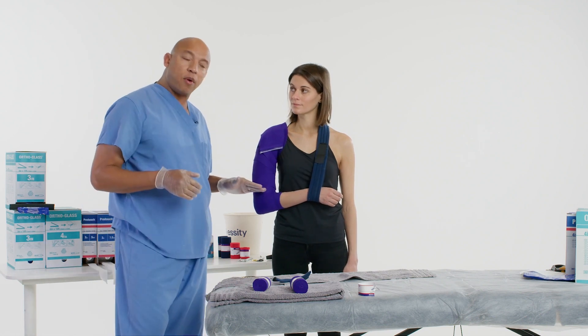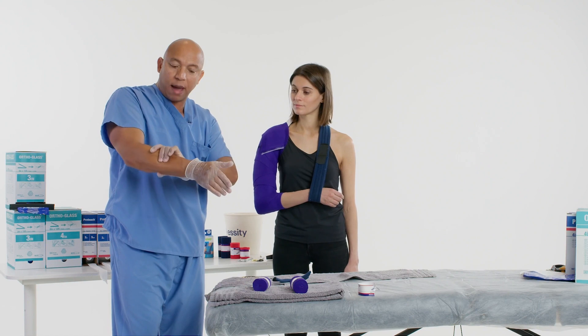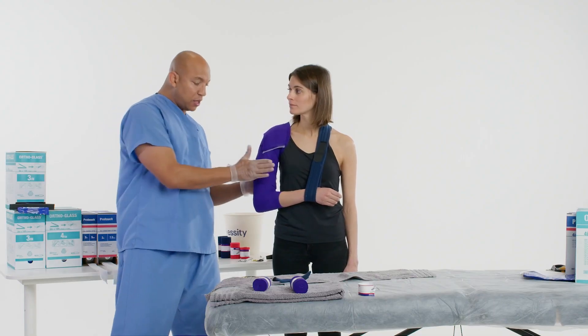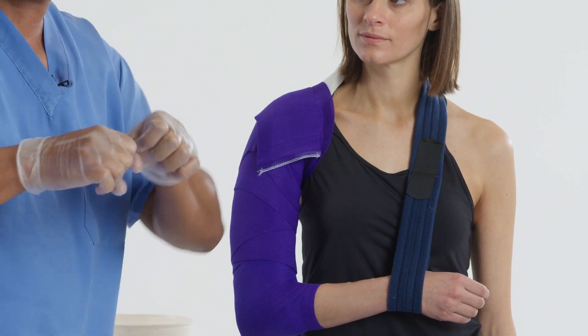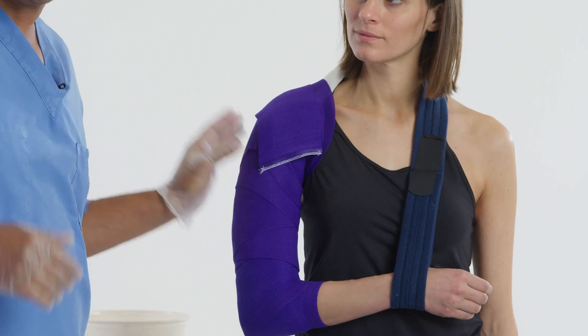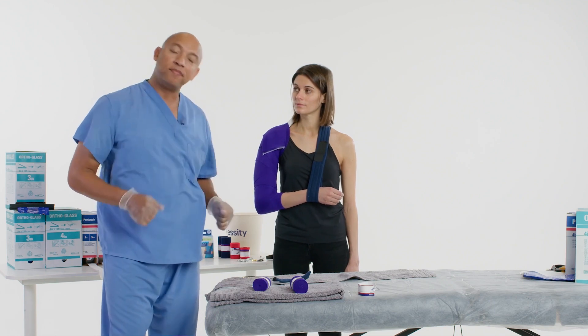Remember, the patient needs to be at 90 degrees at the elbow. Be conscious of over-pulling the elastic bandage because we don't want fluid trapped, which starts to put a lot of pressure on the lower portion of the hand and wrist. If you can get this on quickly, it allows the provider to do the mold needed for immobilization. The portion going around the patient's neck has a terrycloth feel and doesn't neck down or lose strength, so it's more comfortable for the patient. This is the cooptation splint using ortho glass with sling on the roll as a counterbalance to keep it from sliding down. Thank you. For additional support or training on DeltaCast products, contact your local rep or visit www.essity.com.